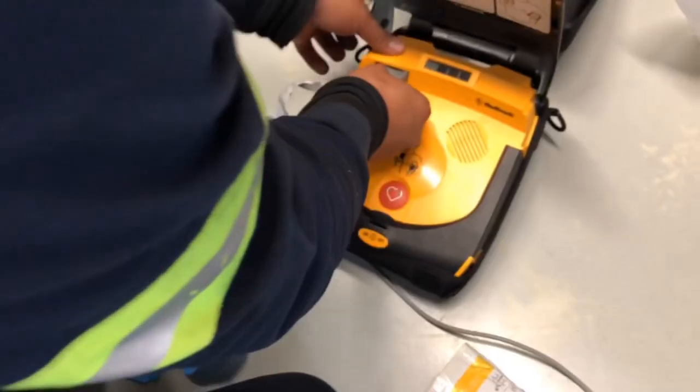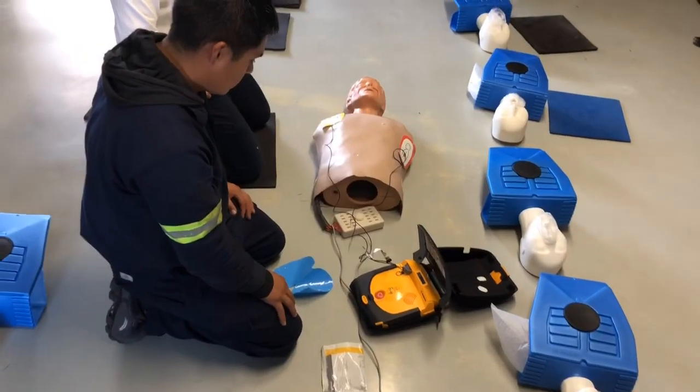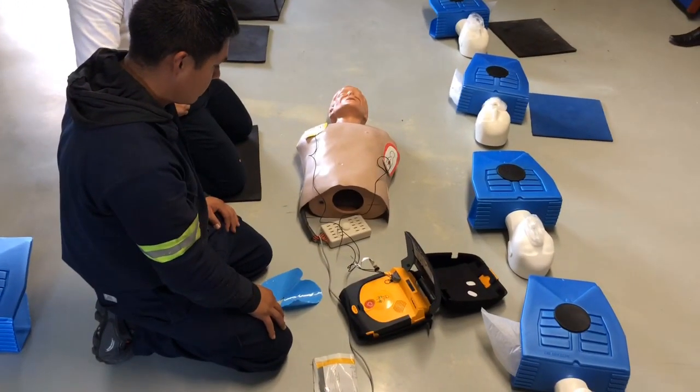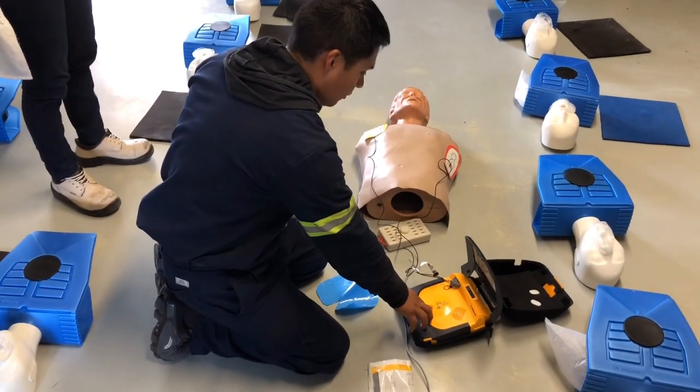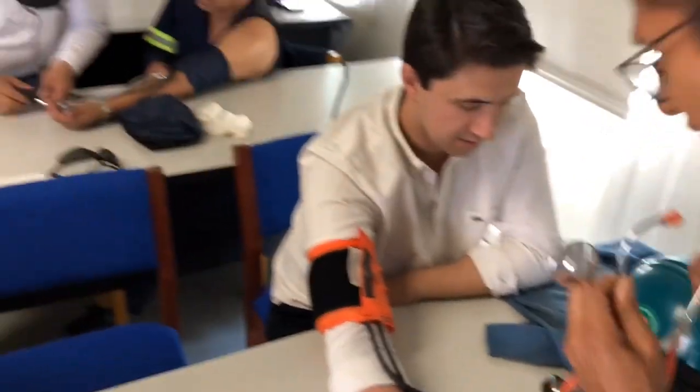No suspendas. Excelente. Porque el maniqu acaba de encontrar fibrilación. Y todos fuera. ¿Y dónde lo dejaste escuchando?